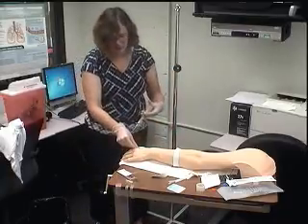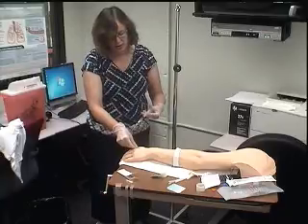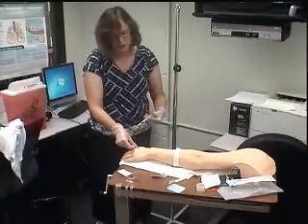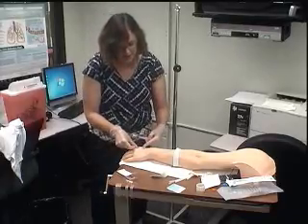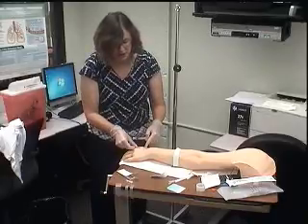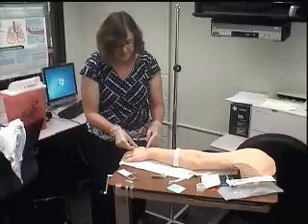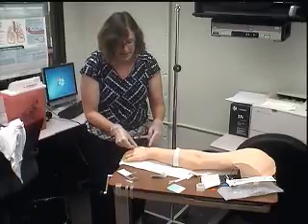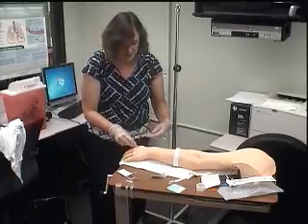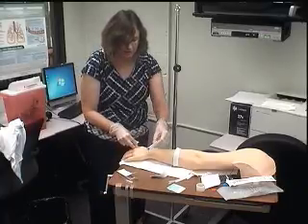Now I'm going to flush it to make sure it's flowing. Does it look like when I'm flushing that it doesn't have a big mess there? When I flushed it, did it look like it was infiltrated? I don't want to see any saline going underneath the tissue in the skin, any big bumps. And then once I flush that, I can go ahead and take that off.